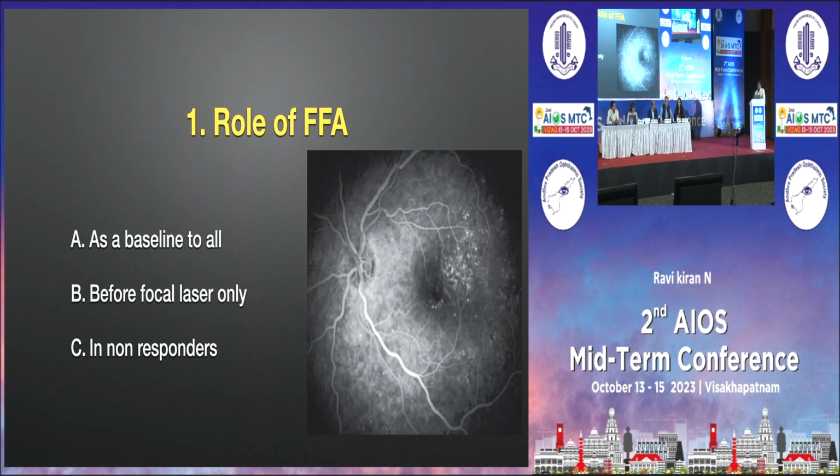No, I will do FA when the patient is coming for the first time, in all of them, as a baseline. There is a reason for that, because so many times we have picked up non-perfusion areas or CNP areas or neovascularization elsewhere. If the OCT is raised, maybe I will not, but if the OCT is not raised, then 100% FA.